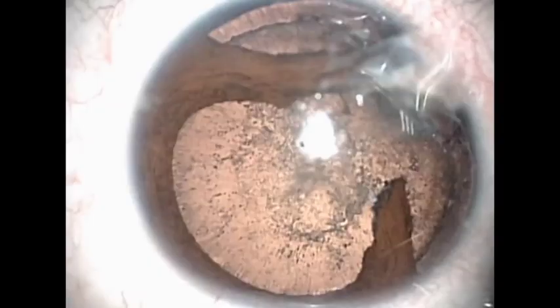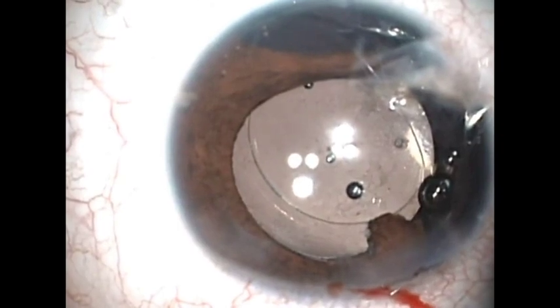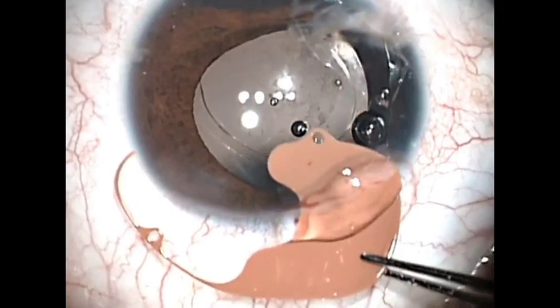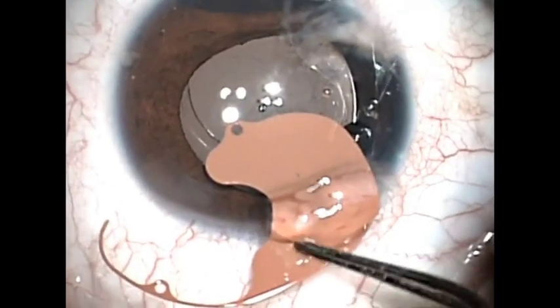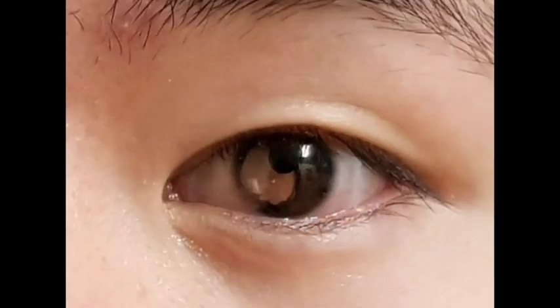In this patient we decided to implant the most simple and the most thin system inside the capsule, as the lens was partially lodged inside the wound. Due to this it was necessary to perform partial suture of iridodialysis. Patients should be prepared that these colored iris diaphragms often have brighter shades than would appear in catalogues.